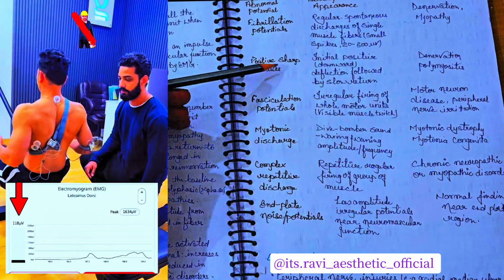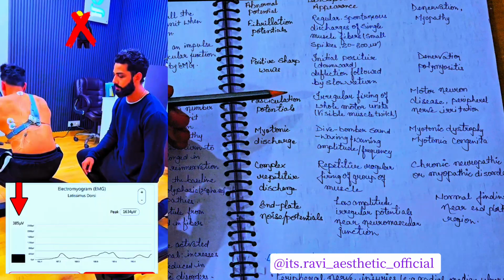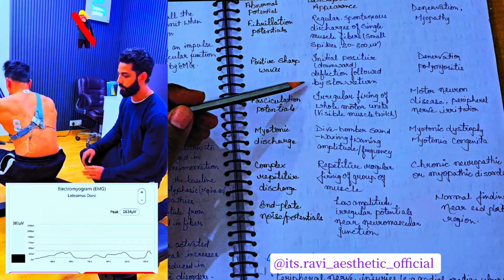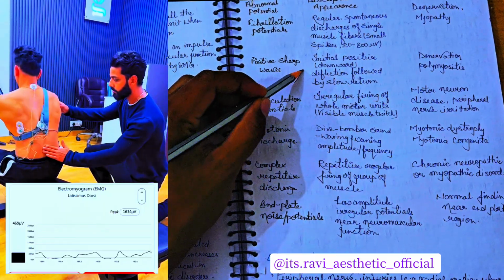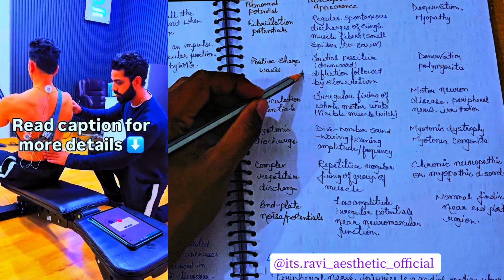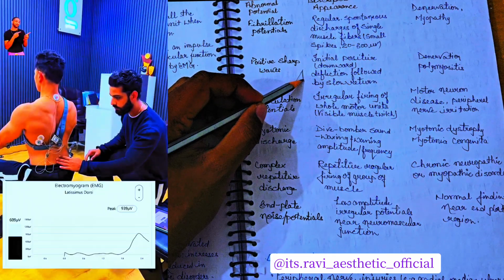Positive sharp waves are shown in denervation and polymyositis. In polymyositis, more than four phases are shown in the electromyographic data: an initial positive downward deflection followed by a slow return. It means it spikes out initially and very fast, then slows down. It indicates degenerated nerve and fibers of skeletal muscle.